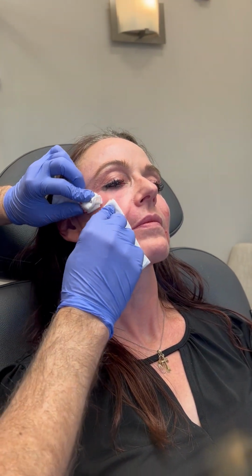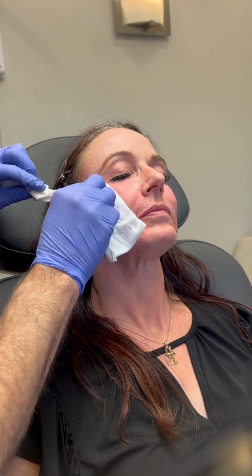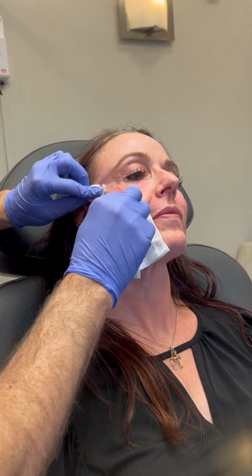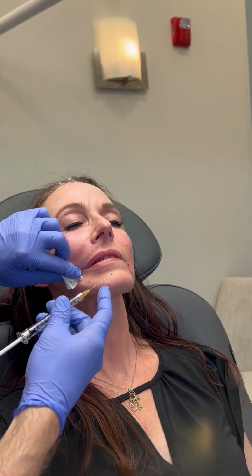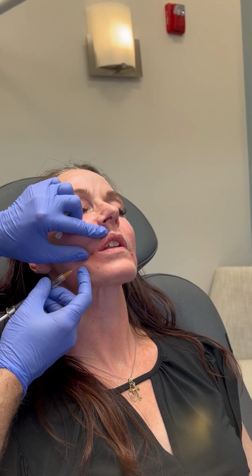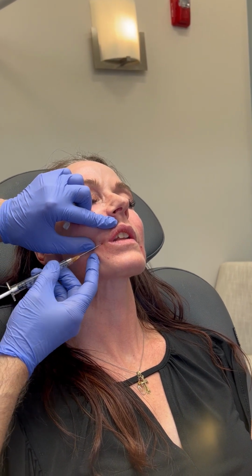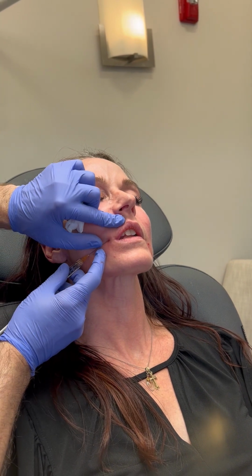And then the last thing is just the lips. And if the lip has a nice shape already, we just want volume, I often will use a cannula. It's a nice area to use a cannula that people don't typically do, but it makes it easier for the patient as well. And it goes in very smoothly. I'm going to use Restylane Kiss here. Again, this is a 1-to-1 blending with saline. And again, we're using a 25 gauge cannula.